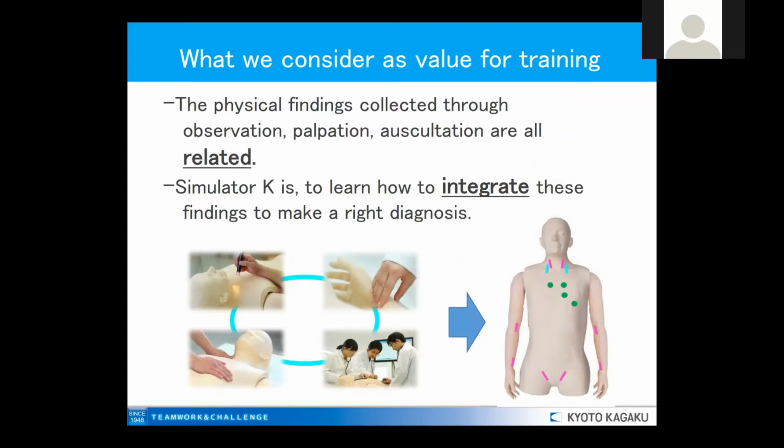So all these things that we just saw, the sounds, the pulses, the palpation of the chest, also the information given on the screen, all this is related and integrated so that at the end of the day, the practitioners become capable of making a diagnosis, linking all the information that they get from their senses, integrating it, and finally making a diagnosis.